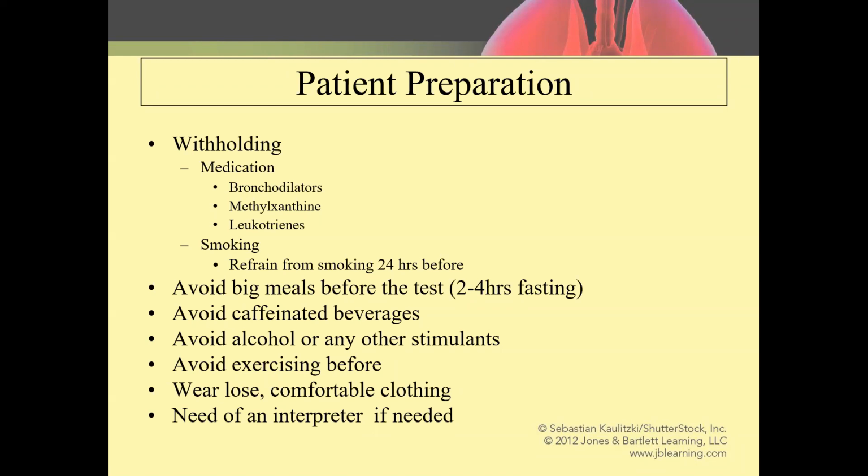Smoking: hopefully, I'm a reformed smoker. I quit almost 15 years ago now, but I'll always bear that stigma of being a former smoker. But in this particular case, if the patient is currently smoking, they should refrain from smoking for at least 24 hours, which is probably a very difficult thing to do. What they need to do is quit altogether. We all kind of know that.